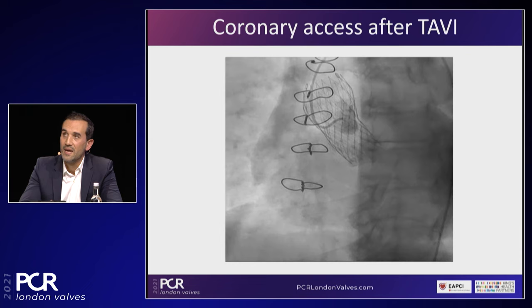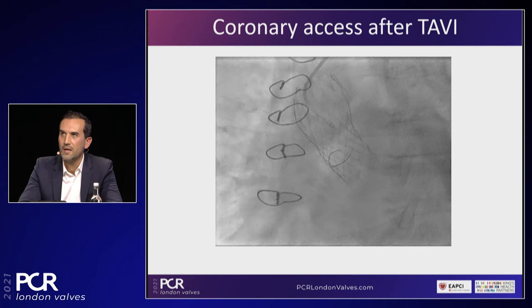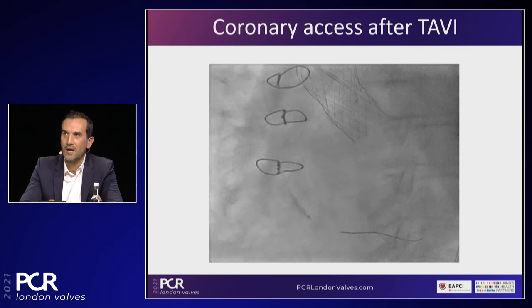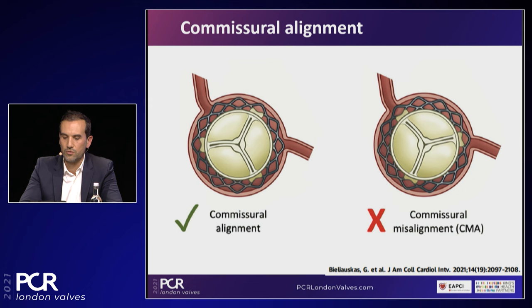So here, of course, if you try to make a direct catheterization to do a regular PCI, you fail. But the idea is just to follow the flow. You see a flow, just follow the flow with your wire. Just advancing a wire following this flow, it was finally not so difficult to cannulate the right coronary artery. And once your wire is here, you will be able to descend a balloon, and having this balloon, use it to anchor yourself and to improve your support, advance a guiding catheter extension, and there it's possible to drive a stent and to do the procedure.